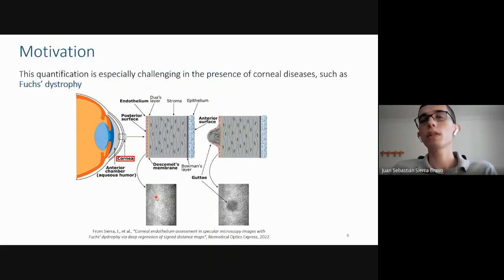This quantification of morphometry parameters is especially challenging in the presence of corneal diseases such as Fuchs' dystrophy, which is one of the most common corneal diseases. In specular microscopy it appears like dark regions, which are produced due to the accumulation of collagen produced by abnormal endothelial cells.